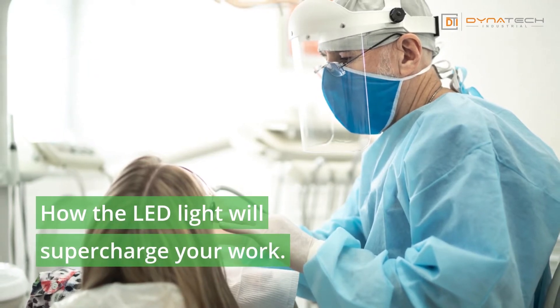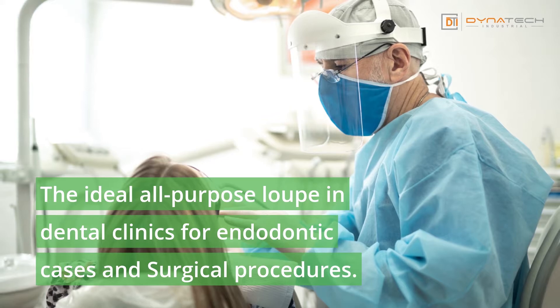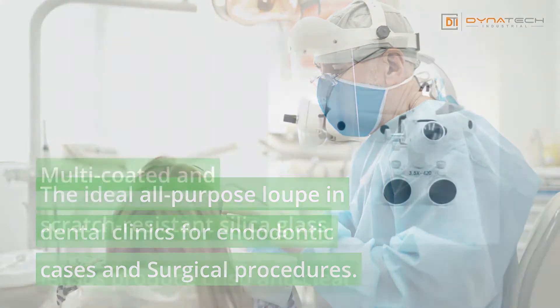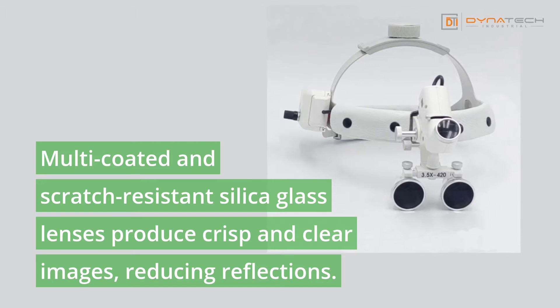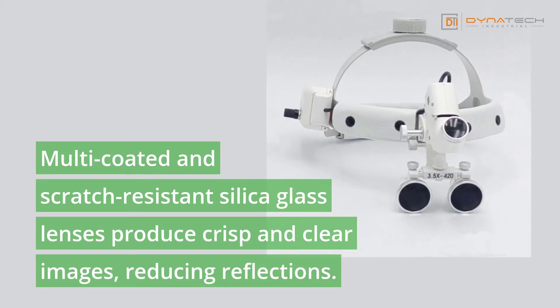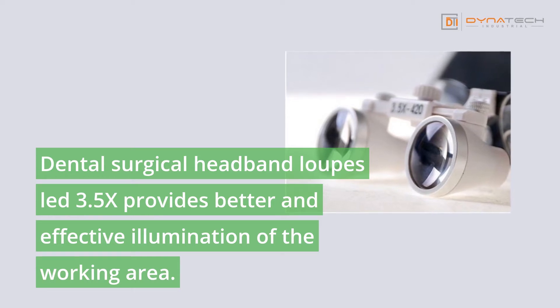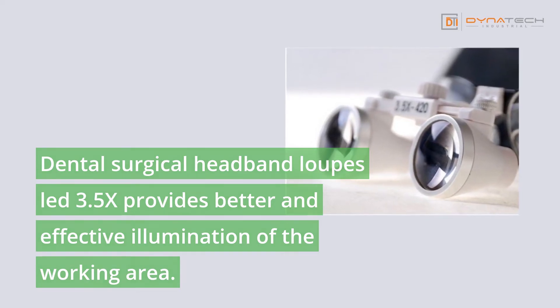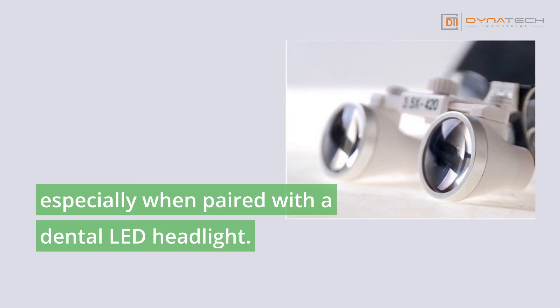How the LED light will supercharge your work — the ideal all-purpose loop in dental clinics for endodontic cases and surgical procedures. Multi-coated and scratch-resistant silica glass lenses produce crisp and clear images, reducing reflections. The dental surgical headband loops LED 3.5X provides better and effective illumination of the working area, especially when paired with a dental LED headlight.